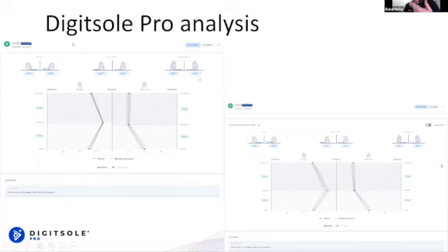And then we go into the propulsion phase, where one of the things that we saw was a kind of whiplash that she did when she was propelling off. She was giving a kind of whiplash with her foot in internal rotation, and when we saw it on the video, we could clearly see that her left lower leg was giving some kind of twist to the knee, whereas the right lower leg was just going straight ahead. That is what we are seeing on the propulsive side here, where we have a kind of accelerated angle on the left foot compared to the right foot, and that is also reproduced down here.